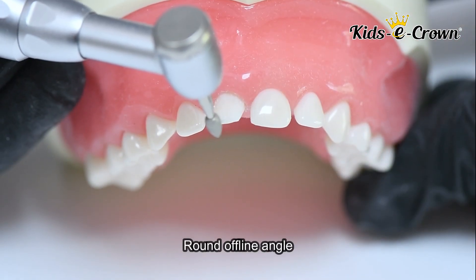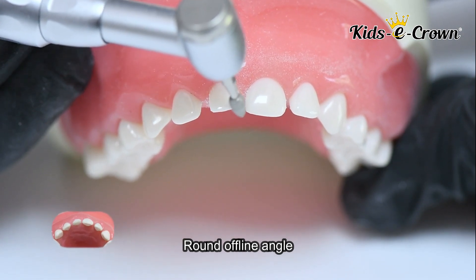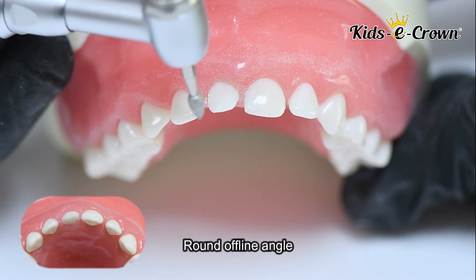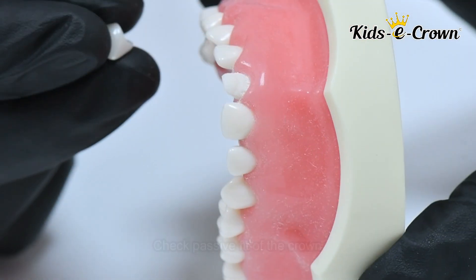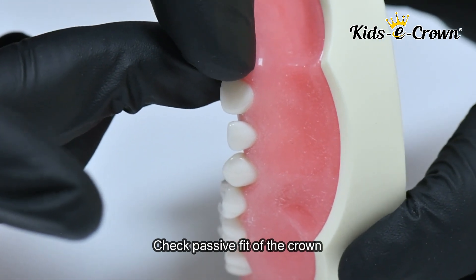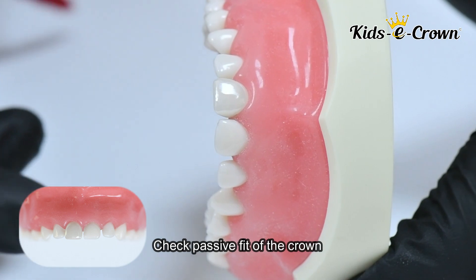The last step is to round off all the sharp line angles. After this, you check the fit of the crown — it should be passively fitted — and then you cement the crown using luting glass ionomer cement.